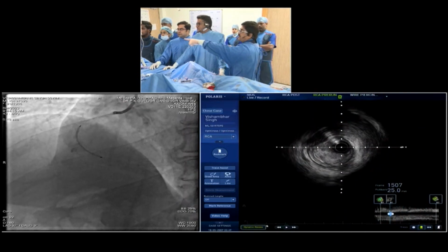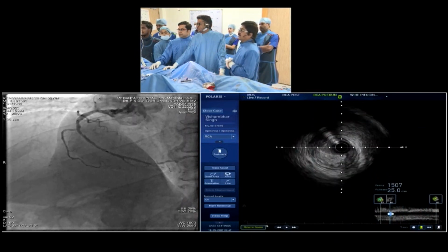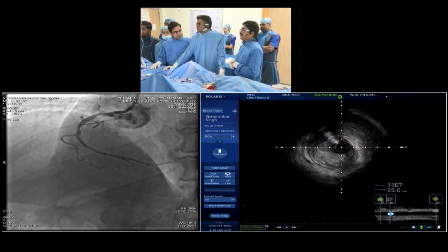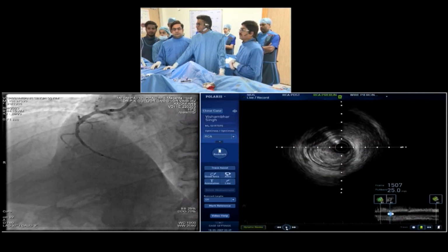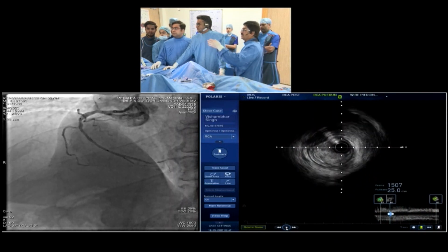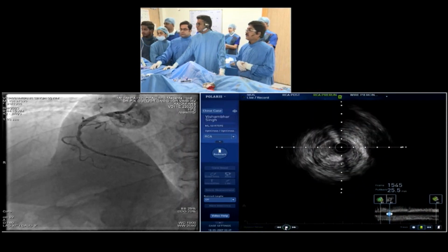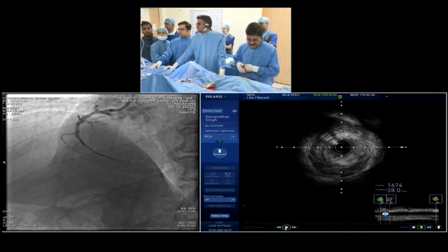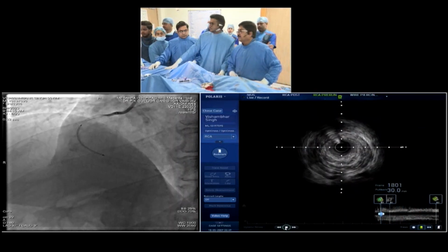Here you see the compressed part, 6 to 8. Consecutively, we can see this is the root, right? So that is what the CTO part was. Was it a bridge or fenestrated in the CTO, I think? Thank you very much for showing this very interesting IVUS image.